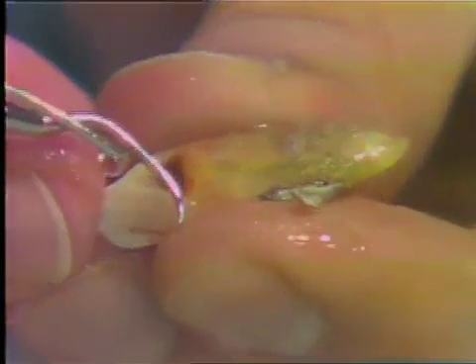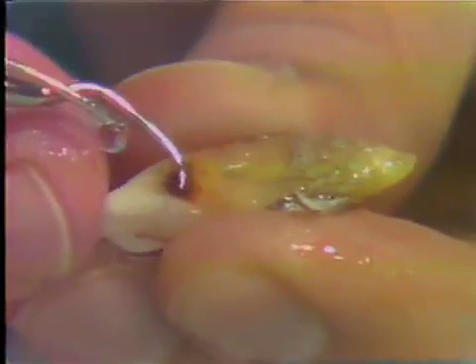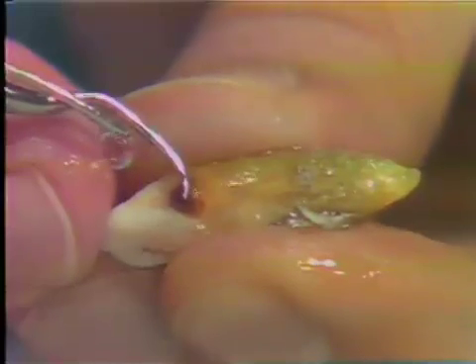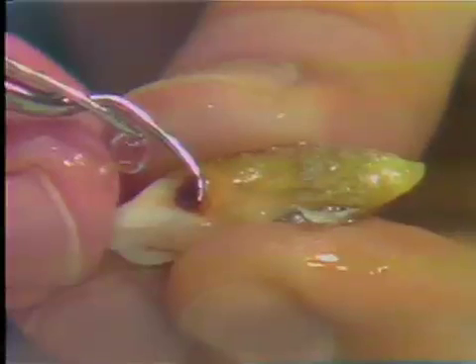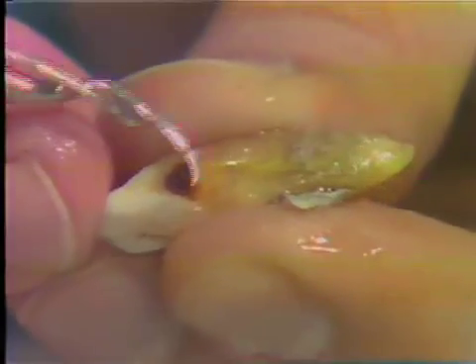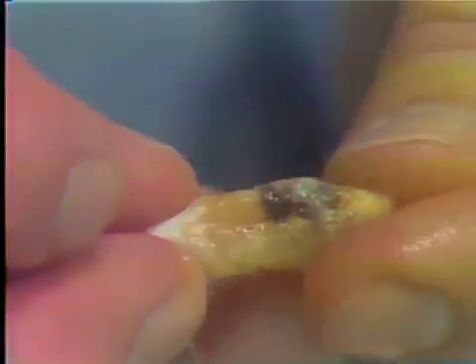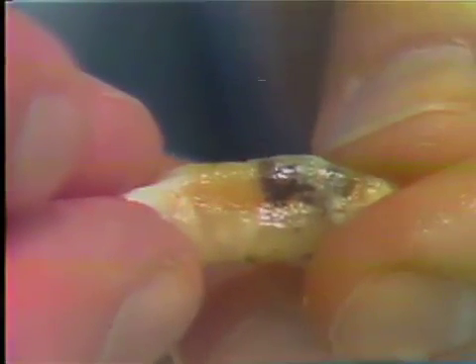This would generally be what we expect to come up with when using that instrument on a root surface. The calculus eventually, by hitting it over and over, begins to fracture away. One thing you see on this extracted tooth that you may not see in the mouth is that these teeth are a little bit dry, so the calculus tends to fracture out a little easier. One problem in the mouth is that you may just burnish over the calculus without actually removing it — this can also be a problem with hand scalers.